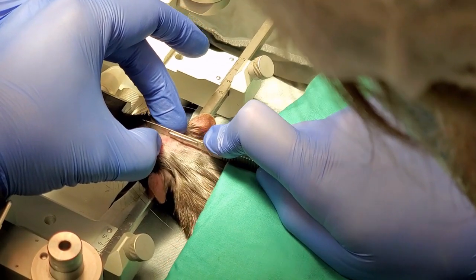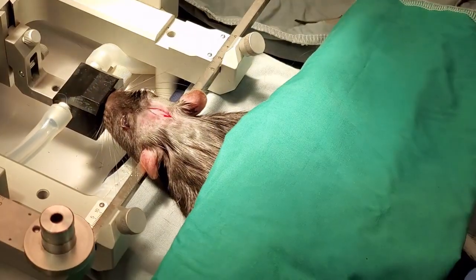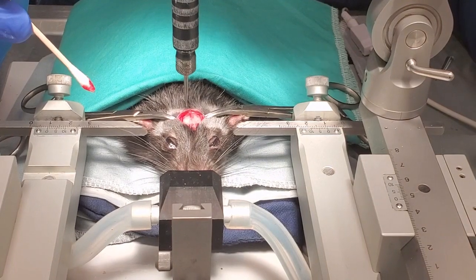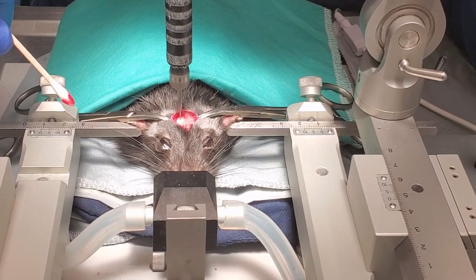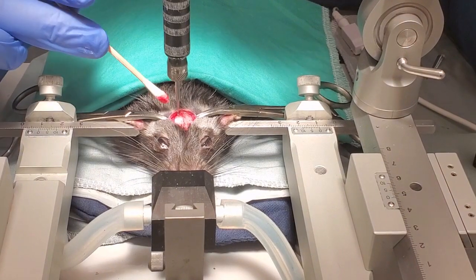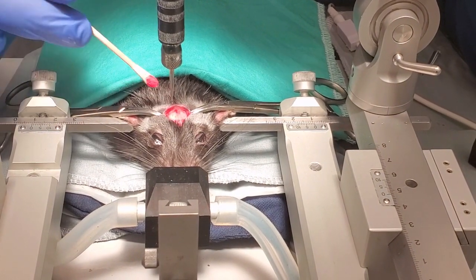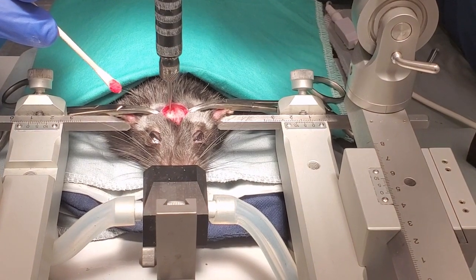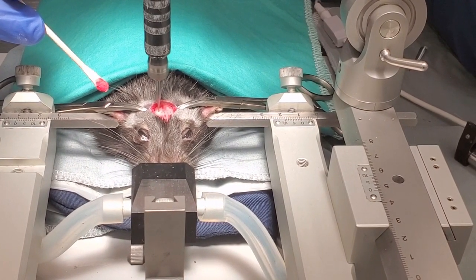Once the head is secure and level, we use a scalpel to make an incision after confirming that the rat is fully under anesthesia. It is important to note that everything in these steps is done under strict aseptic conditions, and although the rat's eyes are open, it is 100% anesthetized. We apply tear gel to the rat's eyes to keep them hydrated throughout the surgery.